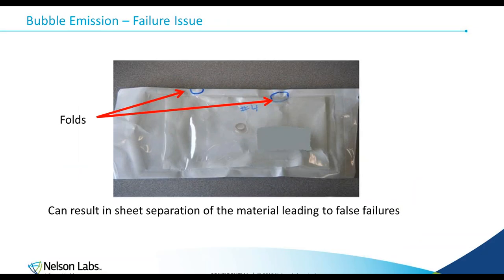Also, when we're testing Tyvek, we have to be careful because there's normal breathing that happens through the actual Tyvek. So essentially what we do is we make a known failure, and then find the adequate test pressure and then subject the packages to that.